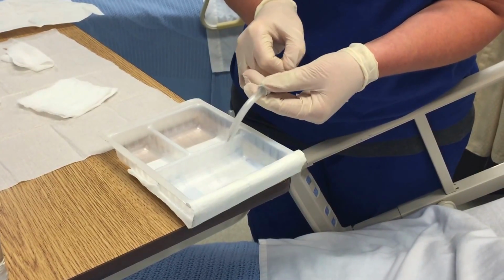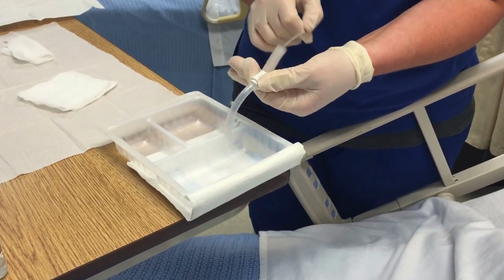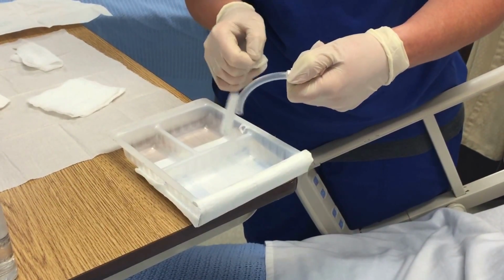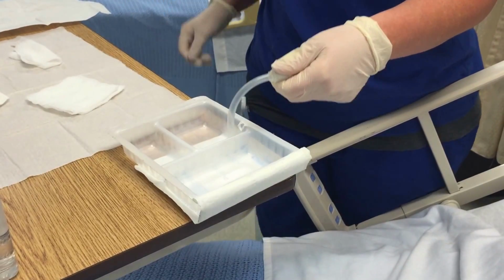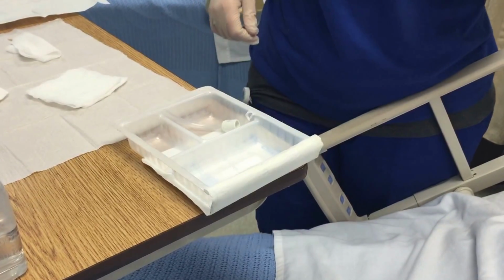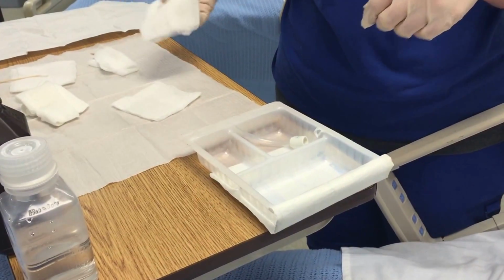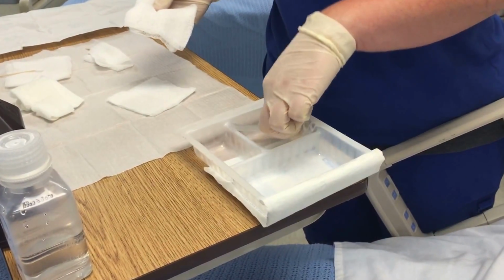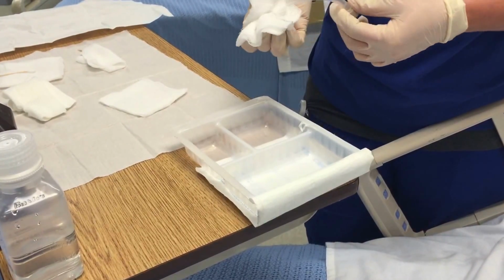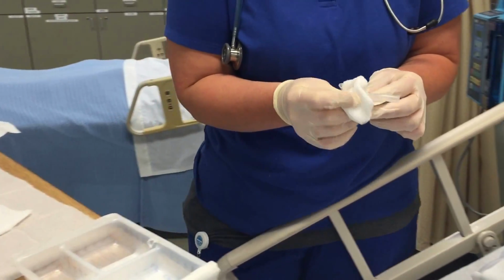Try to keep a good hold on it here. I actually want to just try to hold it by the thing. And then just scrub on the inside, outside. Sometimes you can have some nice gunk there. And then this is done, so it can be pitched. Then it goes in to here. And you're going to take one of your 4x4s, pick this up out of here, and rinse off the excess.